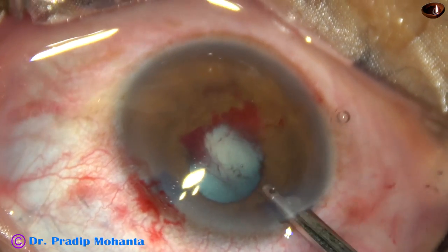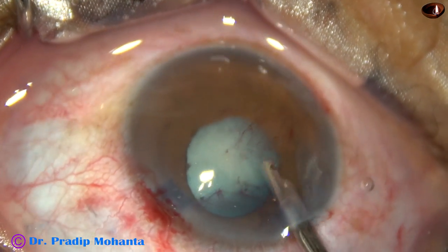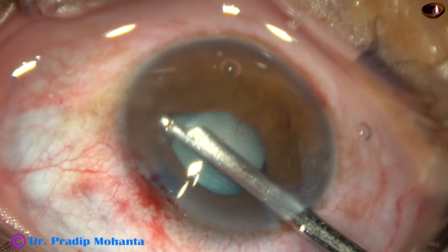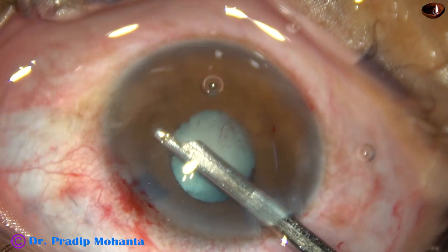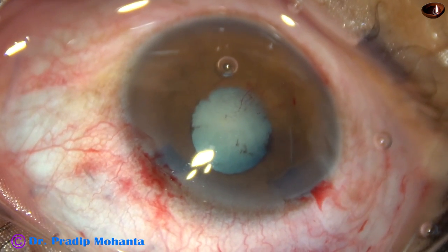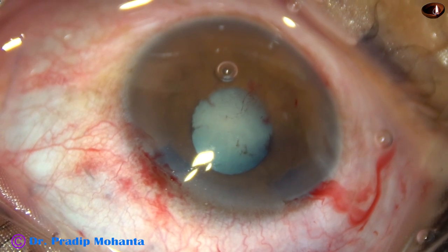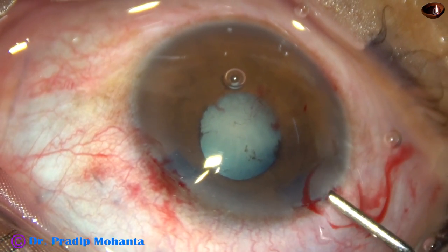There is some little bleeding and it will stop immediately. Now it will be easier to apply a pupil expansion device like Malyugin ring, Canabra ring, or B-hex pupil expander. B-hex means Bhattacharji hexagonal — B for Bhattacharji, hex for hexagonal.